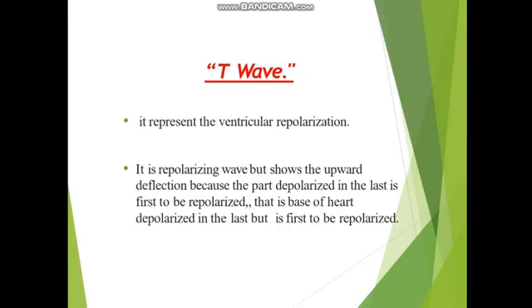T wave, a very important wave. It represents the ventricular repolarization. This wave, I always say, is also an ominous wave. T wave is an ominous wave because of its abnormality. It represents the ventricular repolarization. And it should be downward, but it is ever upward.